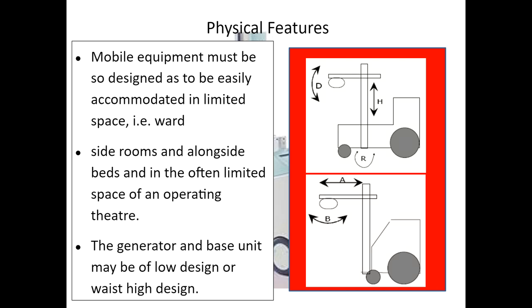Going around corners, you have to be careful. I don't know if you've seen the mirrors that they have set up in a lot of hospitals. You probably don't think about it unless you're in our field and then realize what they're for. I suppose they're for stretchers going around corners as well, so the transporters probably know. But they're hard to position, right? I have found areas that were so tight that just as I was entering the room, I had to move the tube, get it out, and then wheel the tube into place before I even got the entire unit where I wanted.